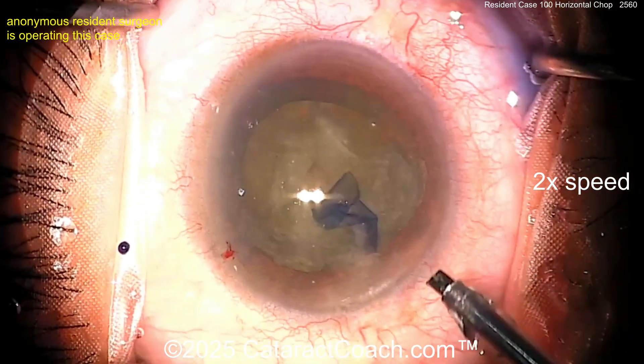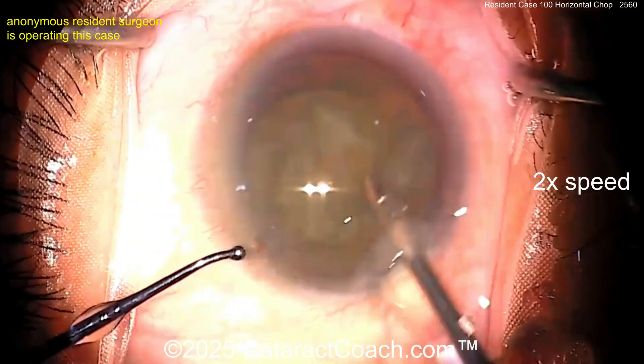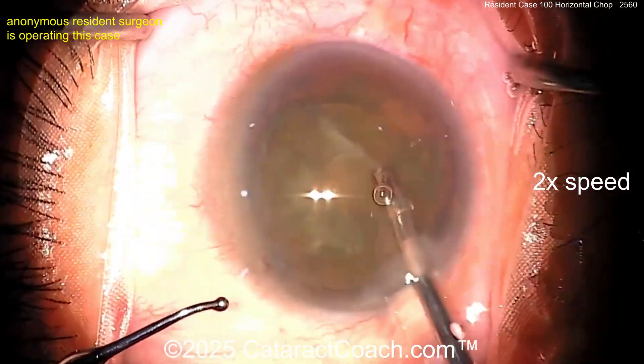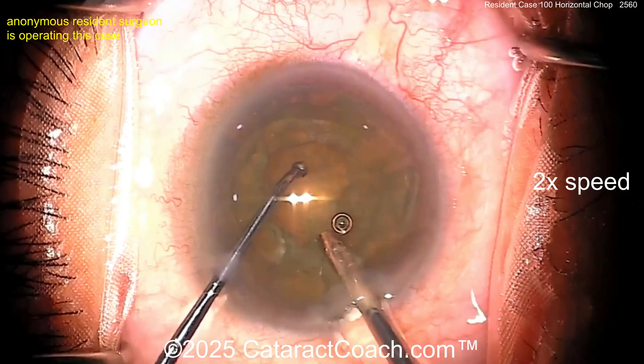Now let's see going in with the phaco probe. I usually pull the capsule flap out with the forceps as I do it, but you can just aspirate that capsule flap with the phaco probe. Take out a little bit of the viscoelastic, make yourself some room, and maybe aspirate some of the anterior cortical material.